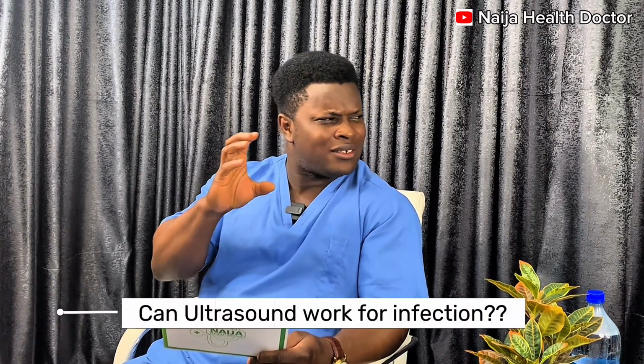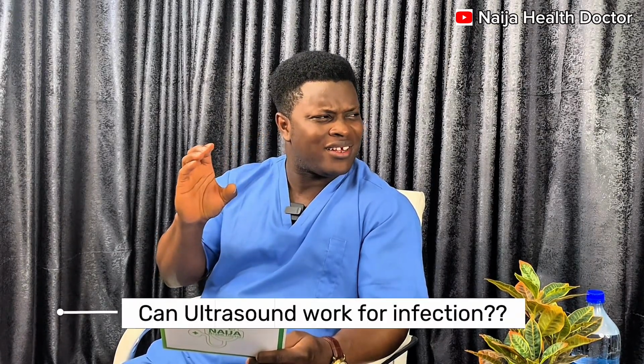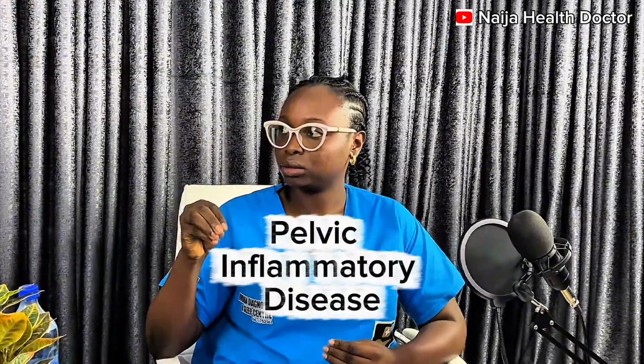Another question I have is, for people with infection, can ultrasound work for that? Yes, we see something in ultrasound when the pouch of Douglas is full. We call it pelvic inflammatory disease. Ultrasound findings. So that's like an infection, definitely. So pouch of Douglas is filled and we record it as either mild or moderate.